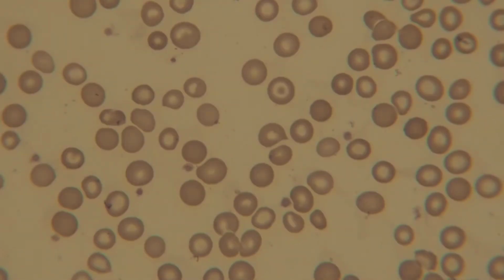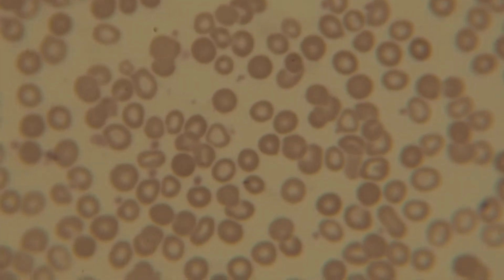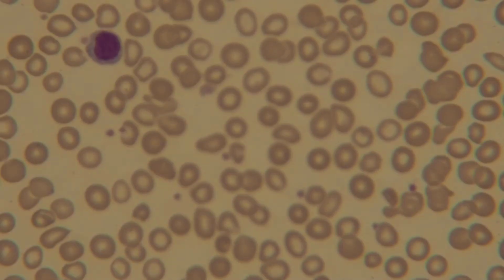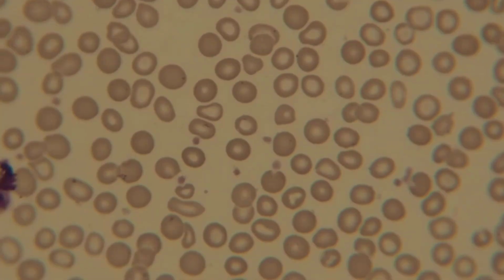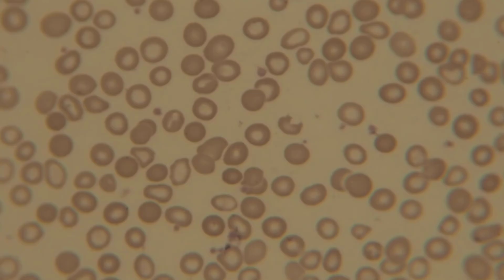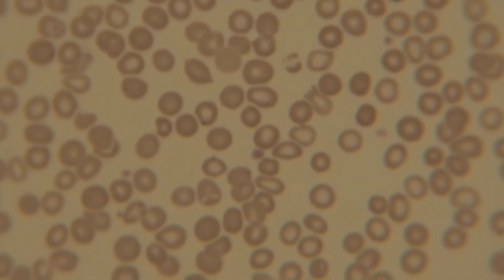Take a look. Lymphocyte. I definitely see some spherocytes too. Target cells, spherocytes.